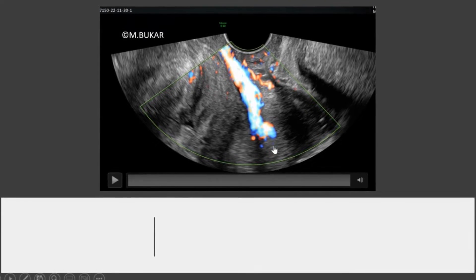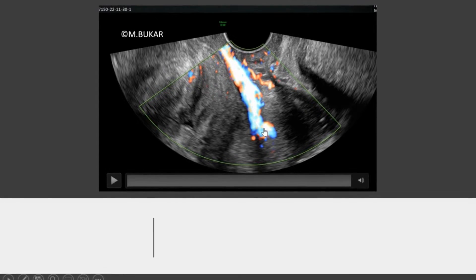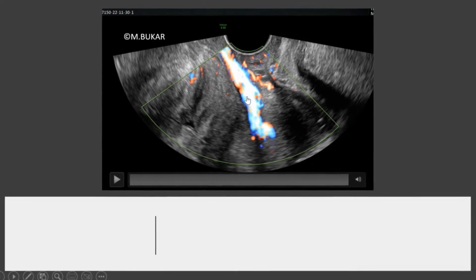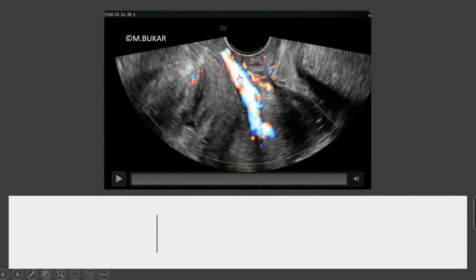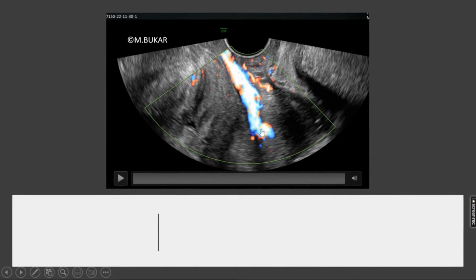This is a high-definition Doppler of the same case, depicting the feeder vessel. The feeder vessel has clearly delineated the origin of the polyp.